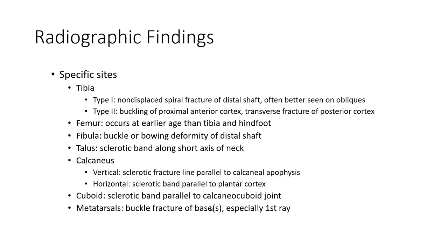Specific findings by site: tibia — non-displaced spiral fracture of the distal shaft, often better seen on oblique view; buckling of the proximal anterior cortex; transverse fracture of the posterior cortex. Femur fractures occur at an earlier age than tibia and hindfoot fractures.